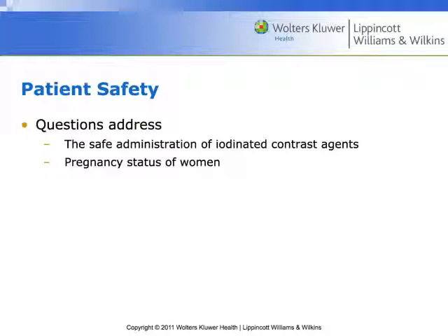Safe administration, testing my IV site. I'm going to hook up a saline syringe and push it as hard as I can into their IV, right? Why am I doing that? Well, that's how quickly I need to flush contrast through that IV, right? I want to make sure that not only is this thing safe and secure and ready to go, it can take a really serious push, right?